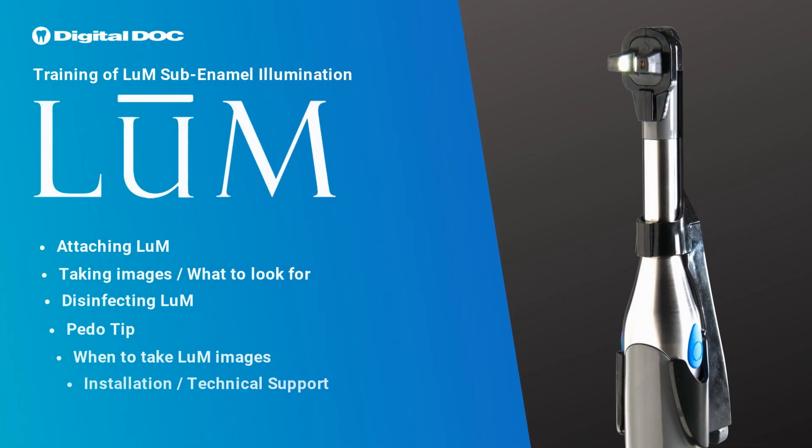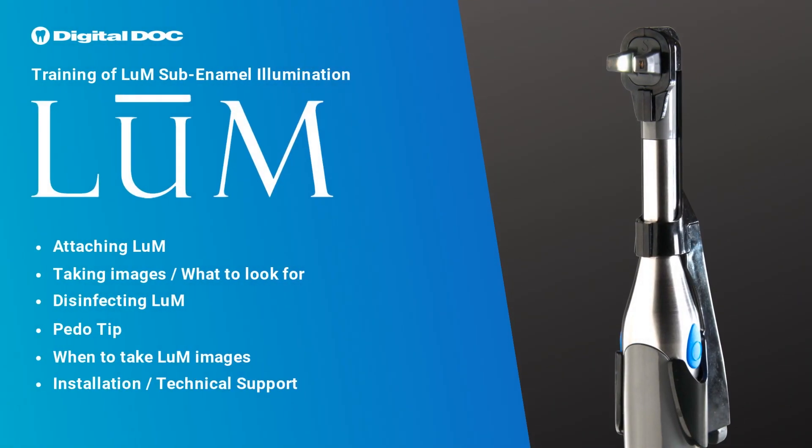Welcome to Digital Doc Training of Loom Sub-Enamel Illumination. Our goal is to show you crystal clear photos so you can base your recommendation off of what you see. We will cover the following: attaching the loom, taking images, what to look for, disinfecting loom, pedo tip, when to take loom images, installation, and technical support.